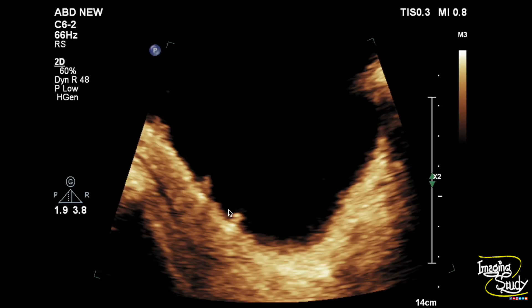Here again is the longitudinal section of the urinary bladder and you can see the irregularity of the wall mimicking polyps. These findings are not conclusive, so to diagnose more precisely we have used three-dimensional ultrasound. Let's see what we have found on 3D ultrasound.